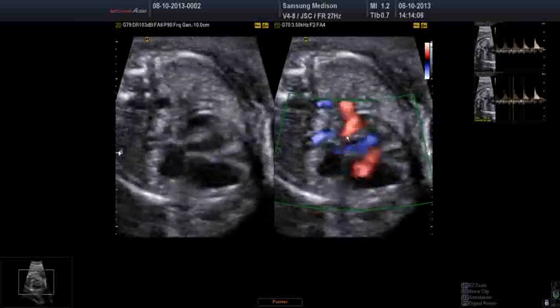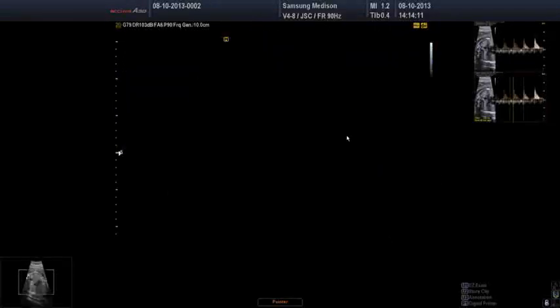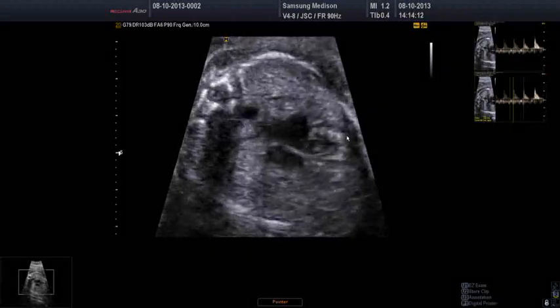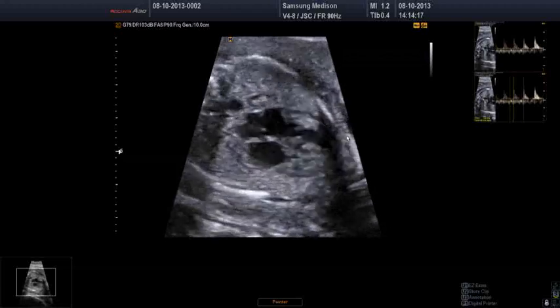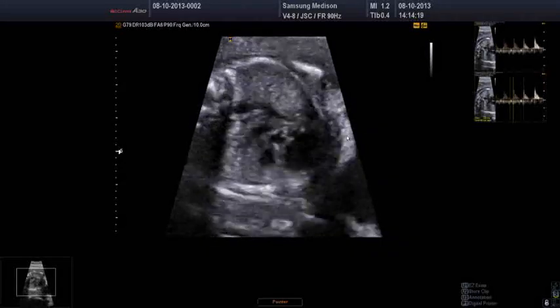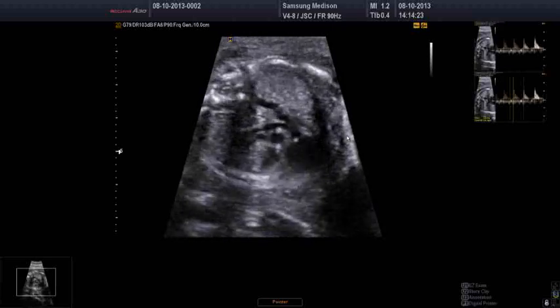But you can see that sometimes it's worth coming from the back rather than from the front if the fetus is closer to the transducer, because the depth might overcome the position. And I think these images are quite clear. Is there anything else that's not clear?